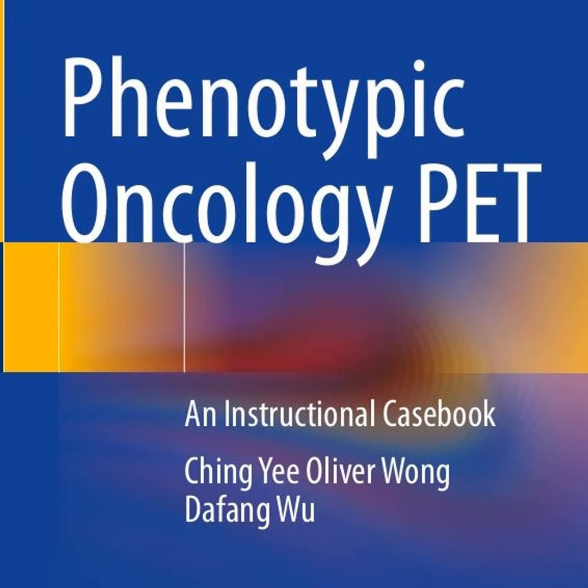Wow. And then you contrast that with a highly aggressive, high-grade lymphoma. Which is a totally different beast. Yeah, those cells are dividing out of control. They are starving for energy, so they literally gorge on the tracer, and they light up brilliantly on the screen. So that dark scan is not a mistake. It is an accurate biological signature of a slow-growing disease.